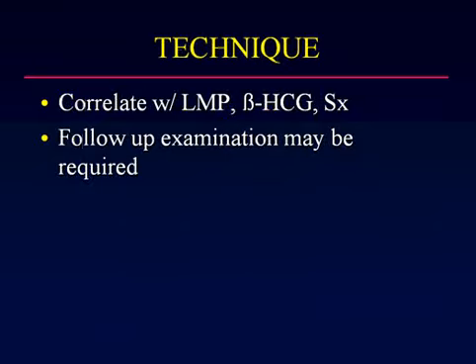And lastly, after you've done your ultrasound, it is extremely important that you correlate your findings with the date of the patient's last menstrual period, the serum beta-HCG level, as well as her symptoms. And we all must recognize that occasionally ultrasound will be negative and follow-up examination may be required to confirm the diagnosis.